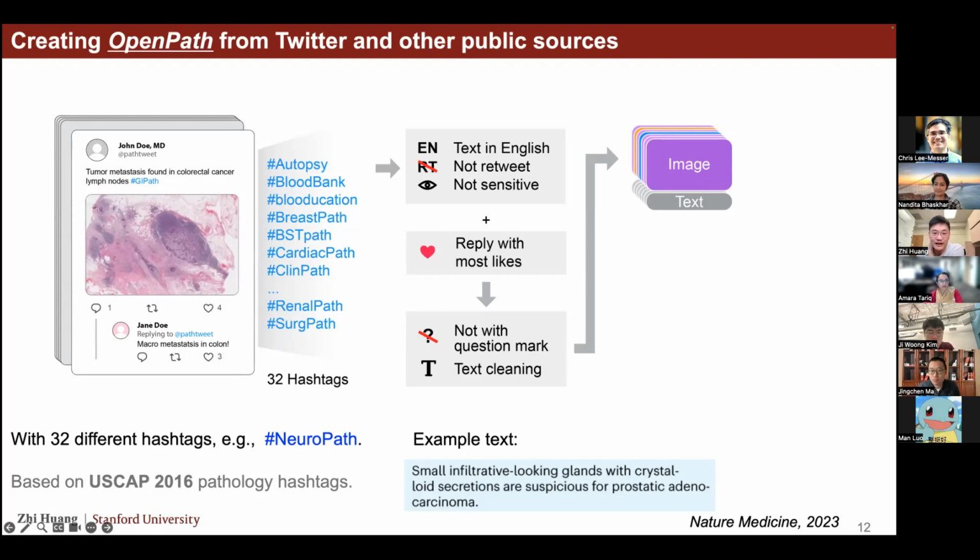So when we started this project, we thought the knowledge from Twitter is really useful because each image patch is associated with a detailed descriptive text. But in the medical school or in the hospital, typically the only text we have is a pathology report, right? And honestly, if you look into the pathology report in the clinical department, it looks like it says a lot, but really it says nothing. It's always describing this slide and this slide. Slides C1, C2, C3 describe a massive tumor, and that's it.